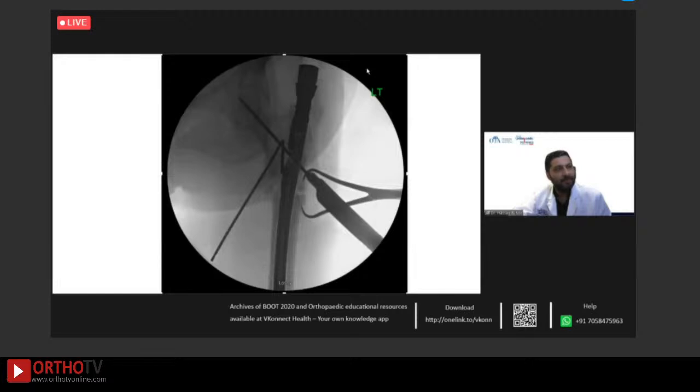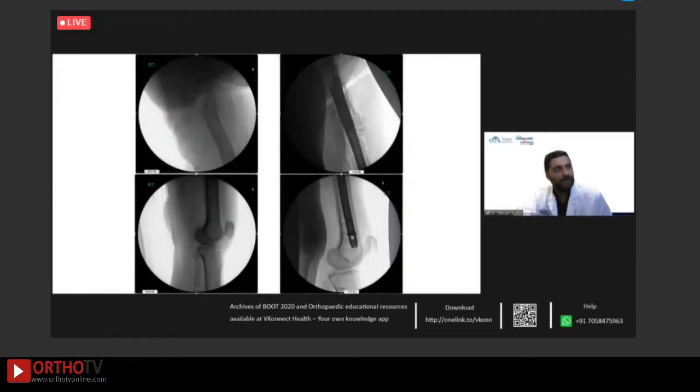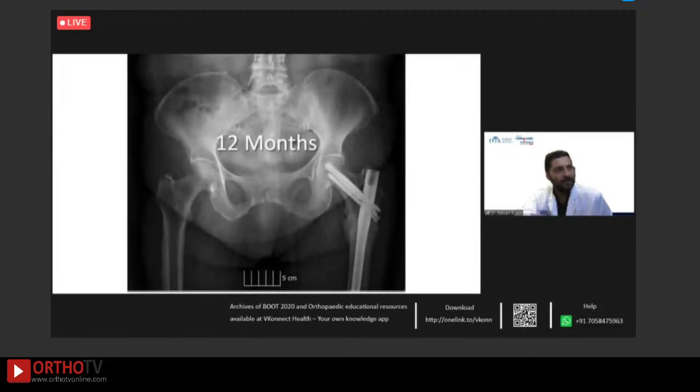Next, this is me getting compression. I do agree completely with taking down the atrophic area of bone and drilling it in multiple fragments. I used a blocking wire to help with alignment, in addition to a lateral clamp to help gain compression at the fracture site. And then this was our final length, which we got back within a few millimeters, and our final rotation, which we got back within a few degrees. So that's what we did. Here she was at 1 year, healed, walking back to all activities.